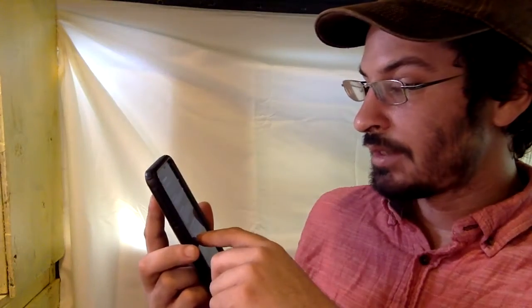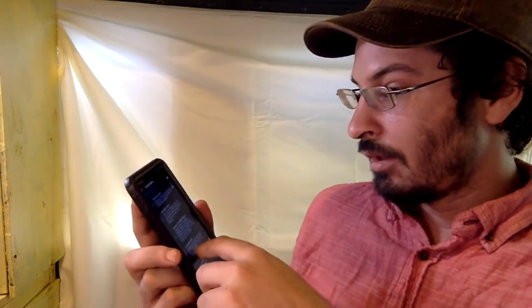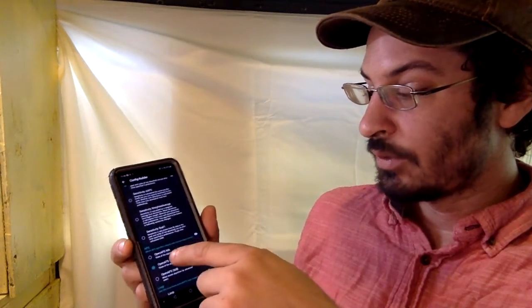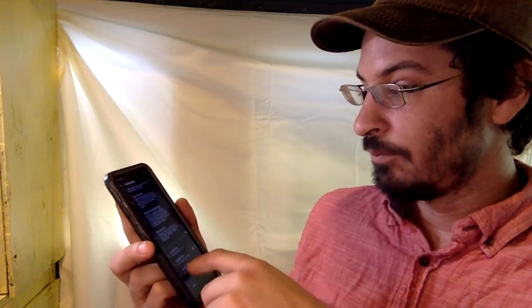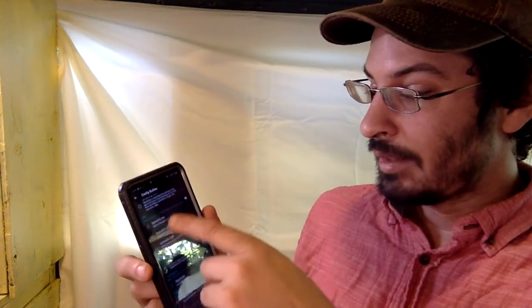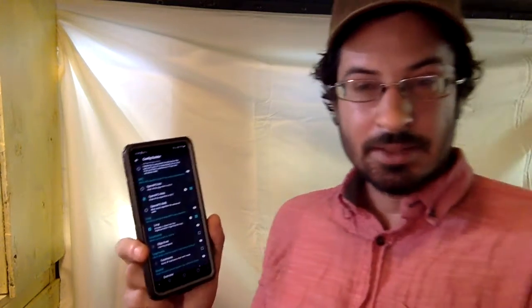So sensitivity detection, this you'll get to learn, but Oref0, I understand you want to use with OpenAPS AMA, and Oref1 you want to use with SMB. And then you get into the artificial pancreas algorithm: MA, AMA, SMB. With SMB, there are some limits if you're using Libre. So AMA will just adjust basal.